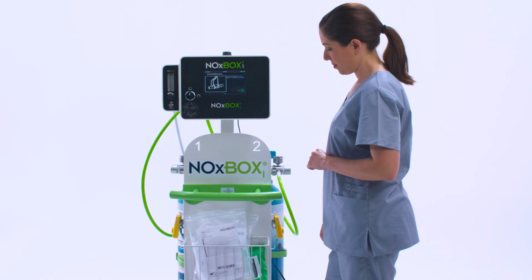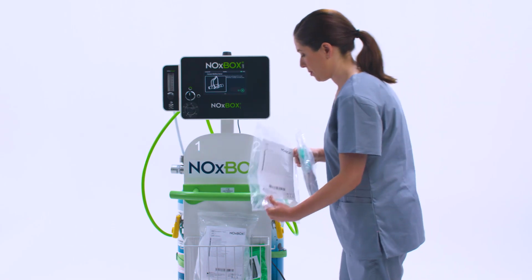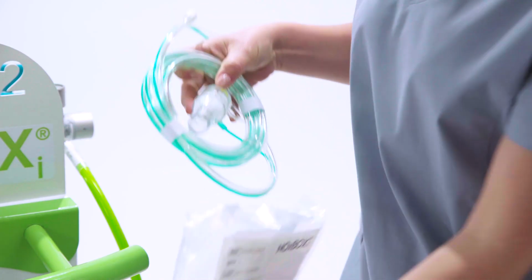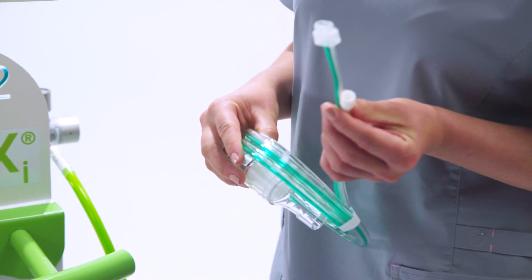With the leak test now complete, we are ready to connect the NOx kit for the system test. Of the 4 available, select the NOx kit appropriate to the prescribed setting and remove the NOx flow sensor, the accessory device that performs flow detection and injects nitric oxide into the breathing circuit.